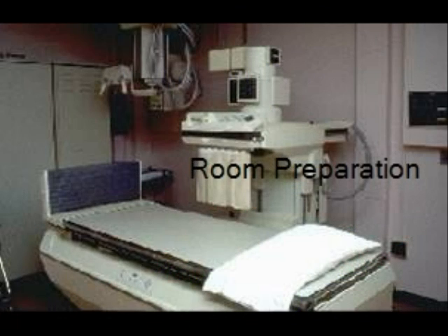Once notification of the patient's arrival has been given to the technologist and the orders have been verified, room preparation should begin. If the room's fluoro and x-ray tube haven't been warmed up, this should be done now. An x-ray room with both a regular tube and a fluoroscopic tube should be utilized. The technologist should prepare the table with a sheet and pillow for the patient's comfort because they may be here for a while. The rest of the supplies should be pulled out of storage and placed in the room, but not opened until the approval of the radiologist is given to conserve materials.